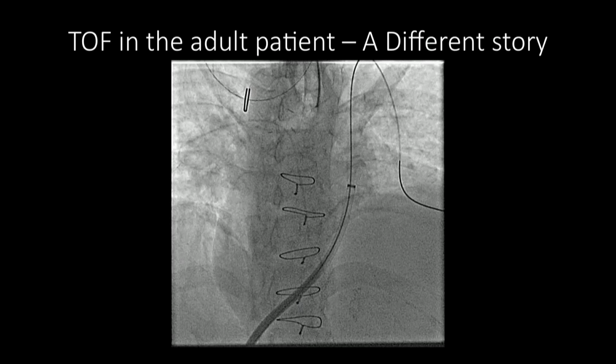But we don't get MRIs every year on these patients, depending on their symptoms. So usually the follow-up is done by echo. The initial diagnosis is done by echocardiogram. So it's very important to provide good images.